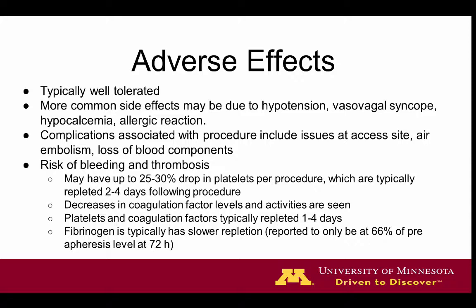Some of the more severe complications include issues with the access site itself, potentially an air embolism and loss of blood components. There is some risk of bleeding and thrombosis with centrifugation and running the blood through the machine. There is that potential that platelets could be activated and result in a drop of platelets.